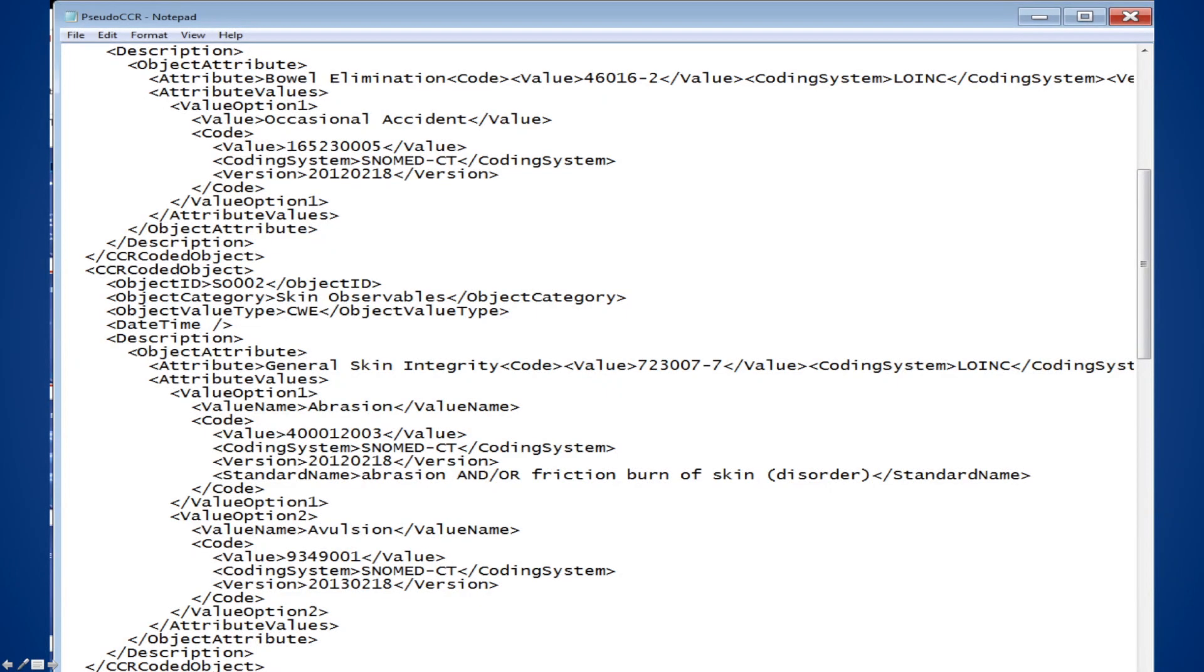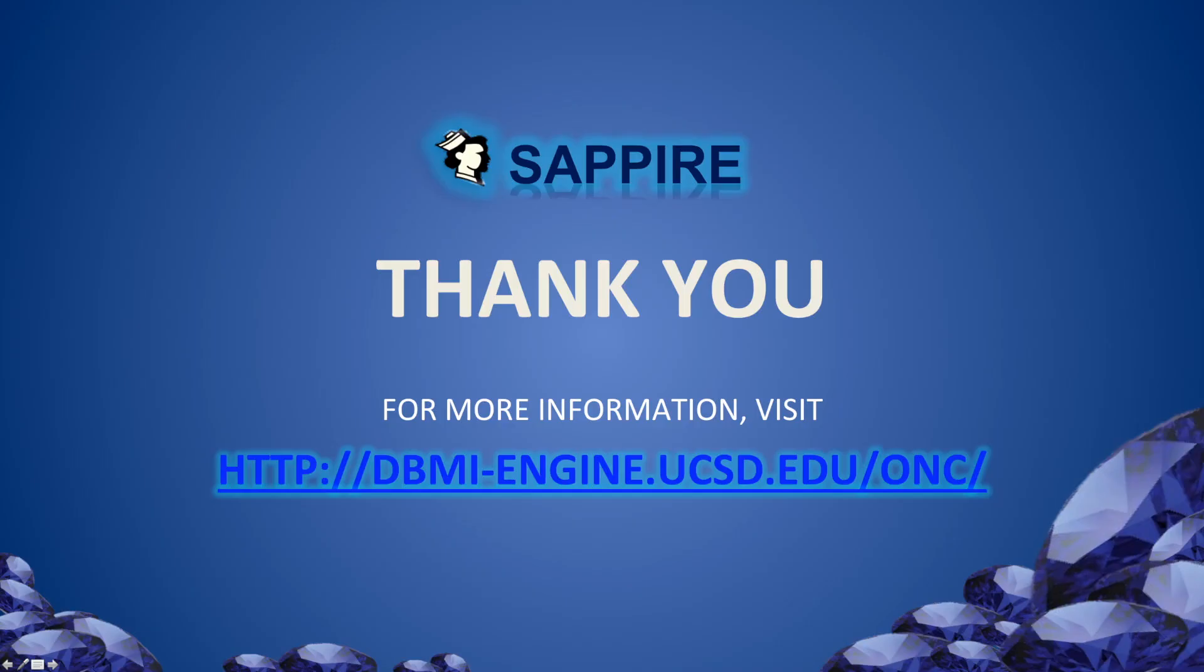This is a snippet of the exported CCR document that shows the standardized concept codes that are attached to the local assessment data. Note that Sapphire uses the results template of CCR. This is the end of the demonstration. Thank you for your attention. For more information, please visit the Sapphire project homepage.